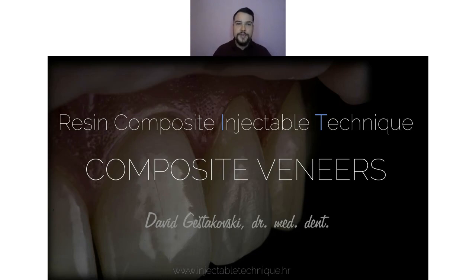Let me introduce myself. My name is David Gestakovsky. I will be speaking today about resin composite injectable technique, about the clinical procedure of this technique in the production of composite veneers. Today we will be speaking about the anteriors, about veneers.